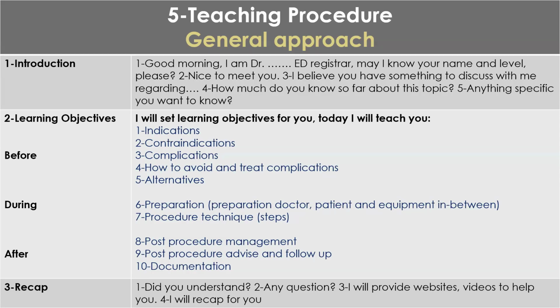Number two, diagnostic and urine output monitoring for fluid in any patient in ICU. So, any patient unconscious or semi-conscious or in a life-threatening condition, you should insert a urinary catheter. Easy? Okay, this is routine.